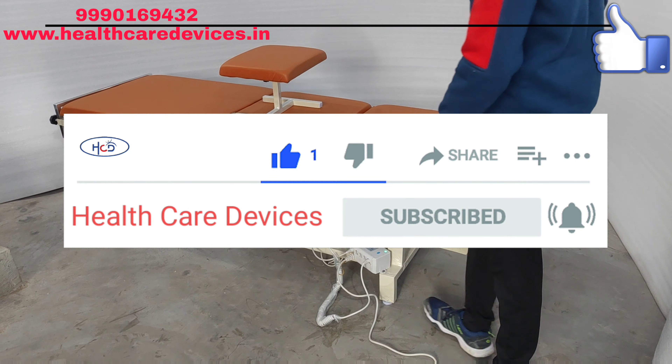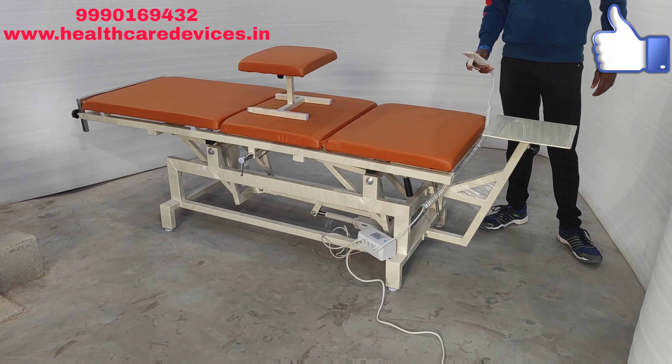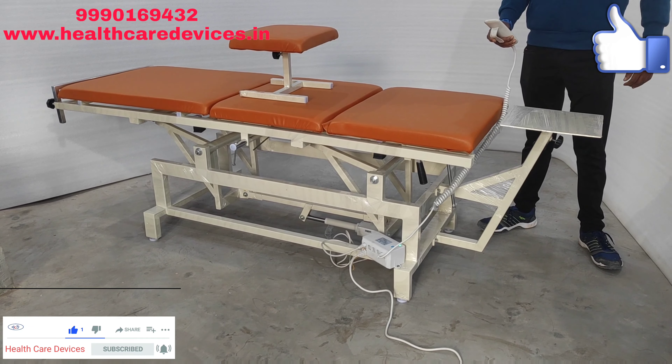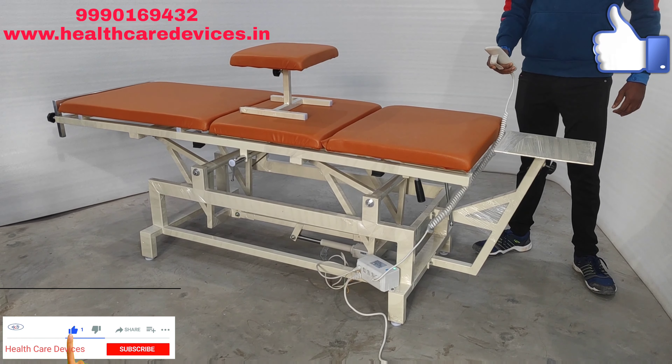So friends, we will do the high-low bed demonstration. The minimum height is 2 feet. The maximum height will go up to 32 inches. So you can set it according to the patient's needs.